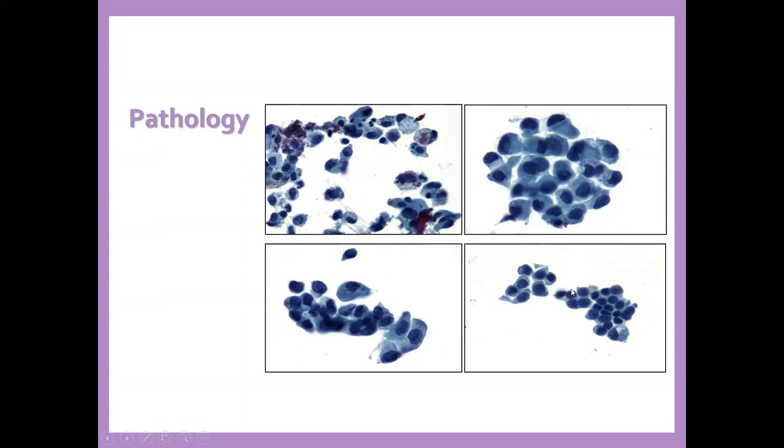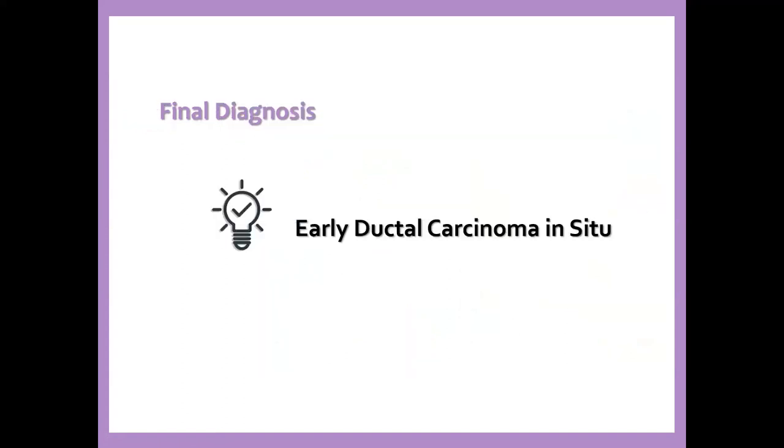So naturally, with nipple discharge or blood in the fluid, cancer is something that has to come to mind. And you see a little bit of red blood cells in some of these cells. So with this abnormality, I just called it malignant. When I called the clinician, he said that there's really nothing else abnormal in this case. And I said, believe me, this patient has cancer and you need to go and do, if not a very nice total mastectomy, at least something to see what is the nature of this nipple discharge.